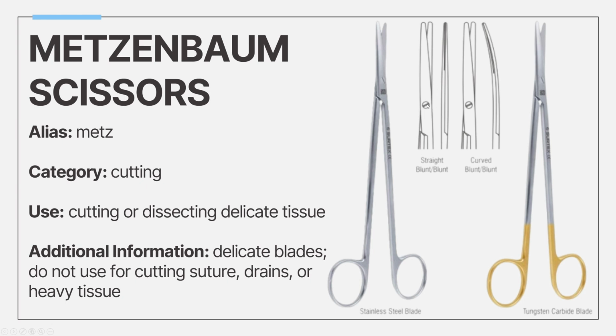So when you talk about operating scissors, let's say a scrub nurse called down to MDRD requesting operating scissors, they always have to let you know what kind of sharpness to give. So they would say, hey, I require an operating scissor up here in OR number 8. You have to ask them, is that a blunt blunt, a sharp blunt, or a sharp sharp?